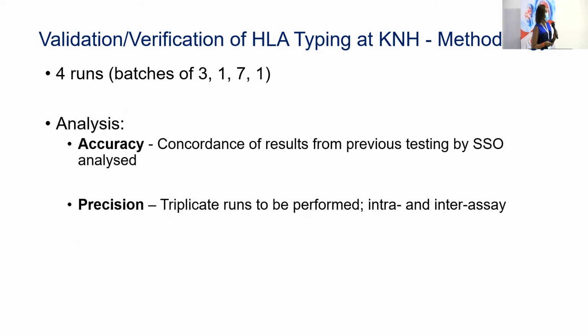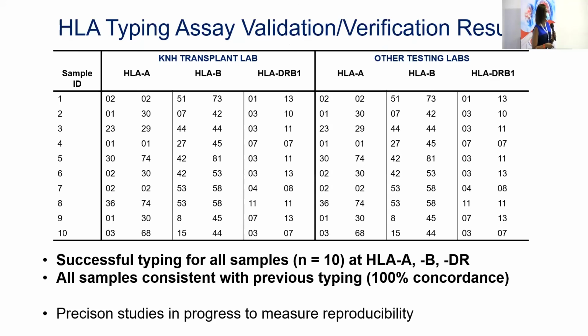Our approach to analysis was just to look at the concordance of our results to the previous testing that was done. Remember I mentioned that currently we outsource all tests to India or South Africa. For us, most of the patients had been sent to India, but they were tested by the same technique, SSO. So we just compared our results and the previous test results. We are yet to do the precision assays.